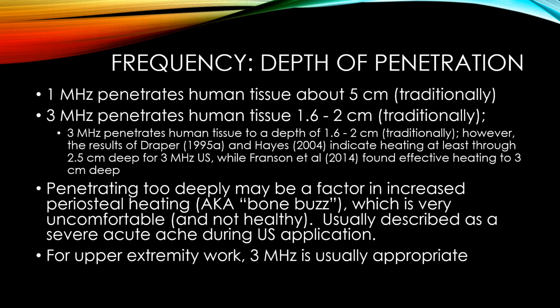However, research has shown that 3 megahertz penetrates much deeper than 1.6 centimeters. A couple of studies indicated heating at least through 2.5 centimeters deep for 3 megahertz ultrasound with no drop-off in heating from more superficial structures. And another study found effective heating with 3 megahertz ultrasound all the way to 3 centimeters deep.